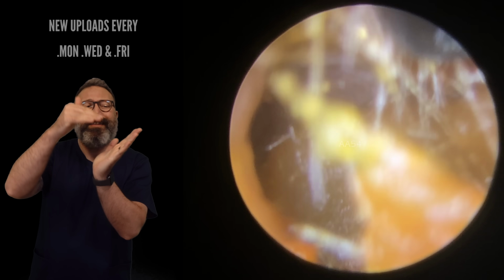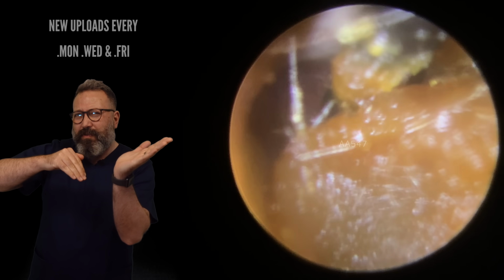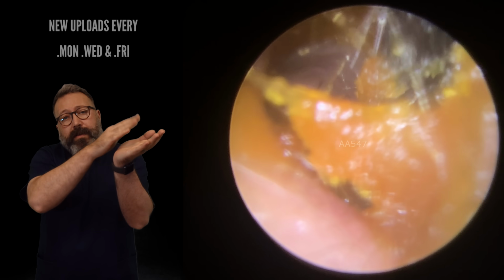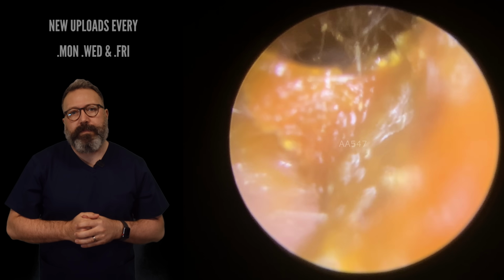Only because to get this thin layer, you have to drop behind it and drag the Jobson horn across the canal wall, which isn't particularly pleasant. But if you go in with a suction tube and lift, it's a lot nicer for the patient. But we'll carry on with the Jobson horn for the time being.